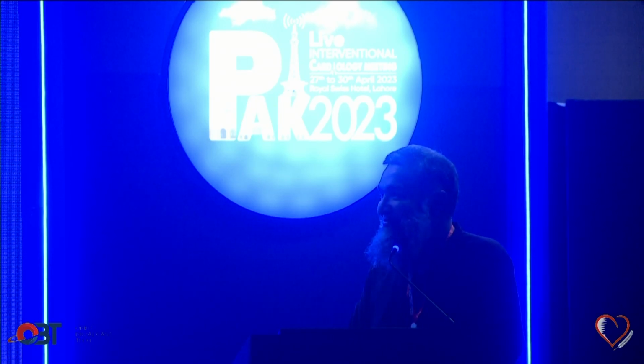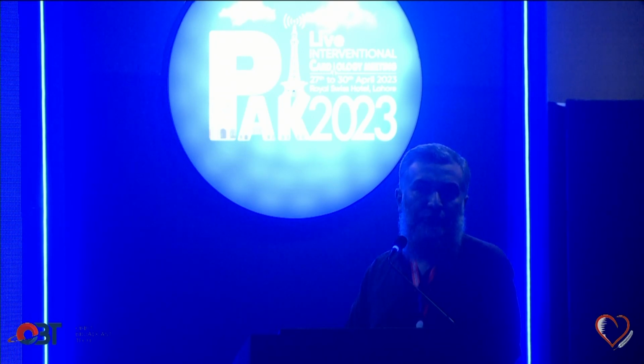It was a nice presentation, and the technique was very good. It was very basic, covering septal puncture, moving from the SVC to the right atrium and to the septum, RAO and the left atrium and the left lateral view.